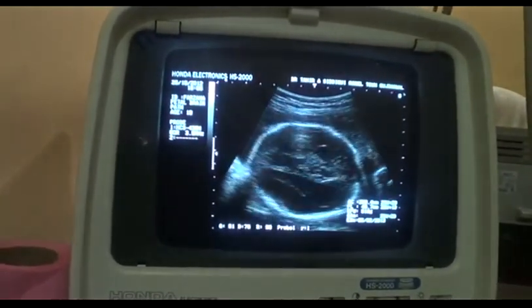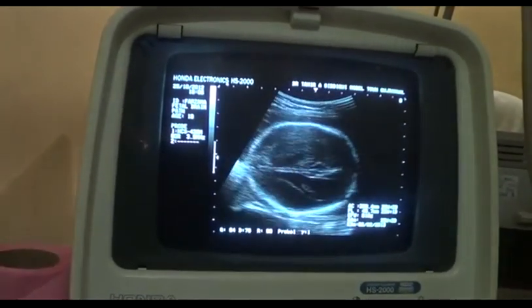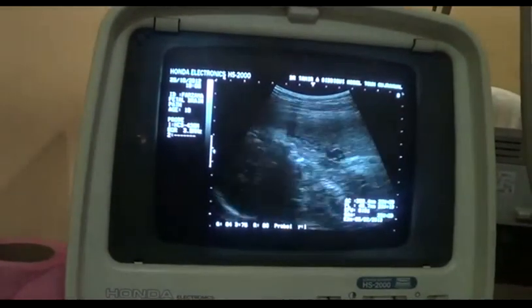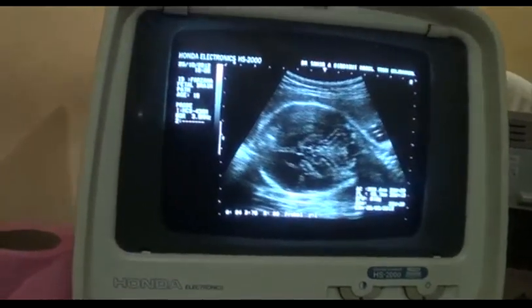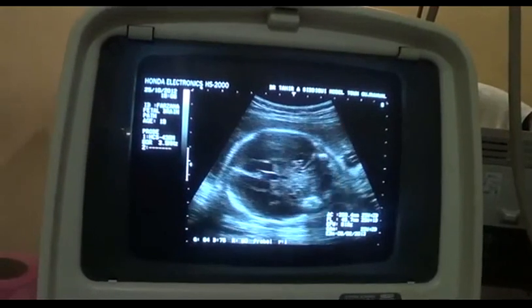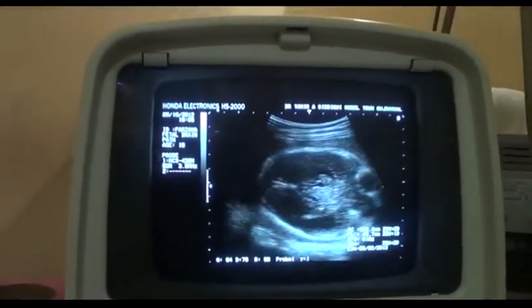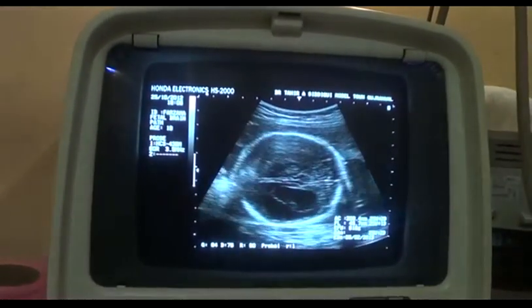It's bilateral because of the pathology, neurological pathology seen in the form of dilated lateral ventricles, clogged third ventricle, and hydrocephalus, as we may say, with loss of cortical mantle.